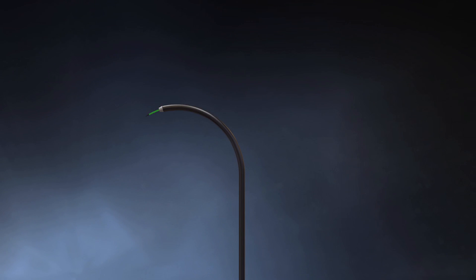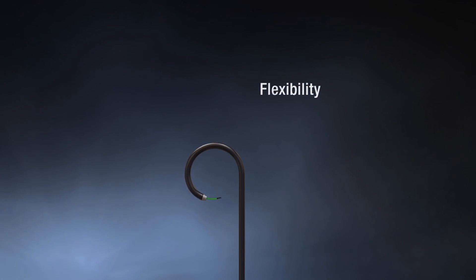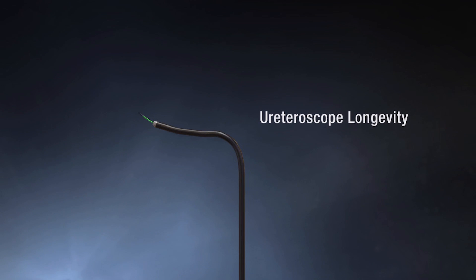An optimized core size of 242 microns allows for scope deflection to reach all areas of the renal pelvis.